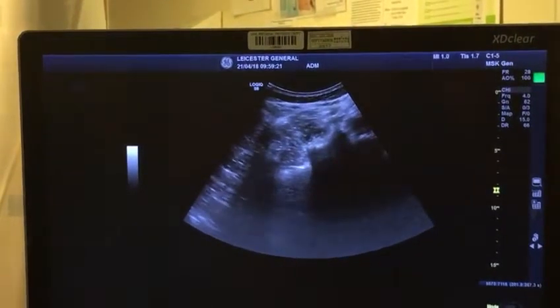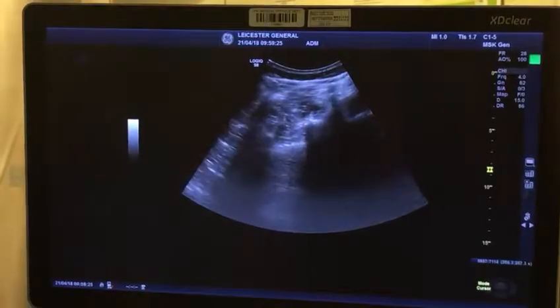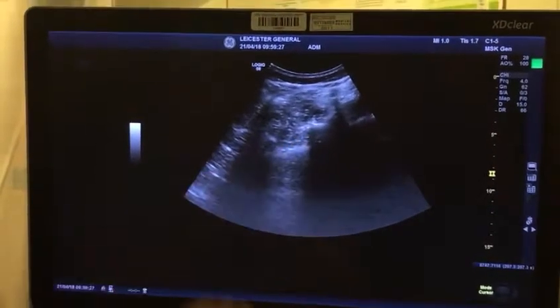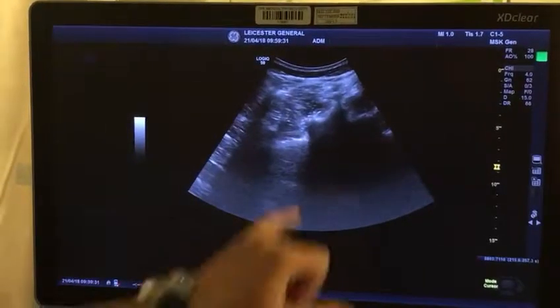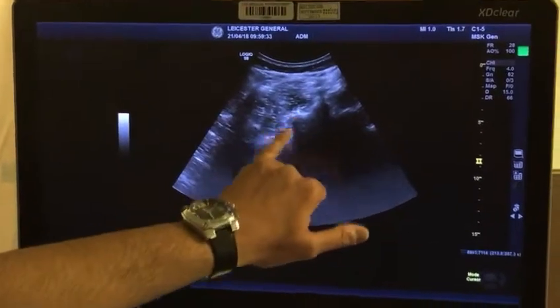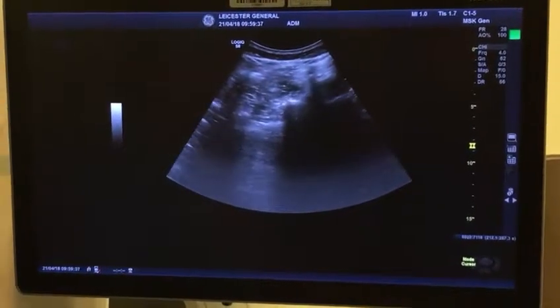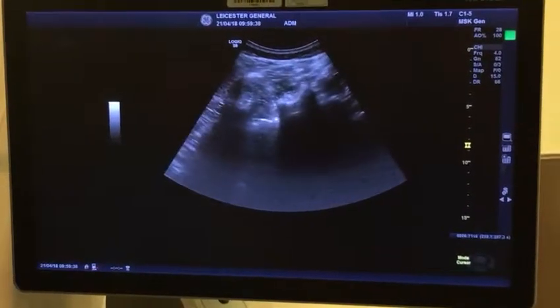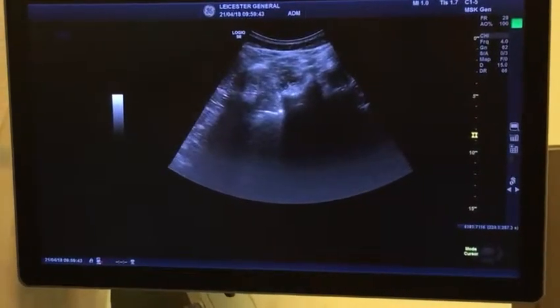Now it's very important to keep in mind that if I move off the target, the next structure I see is a nerve root. Basically, that's the nerve root. So it's very important that you have a really clear bright line between your superior articular process and the transverse process. Otherwise, if you don't have that bright line, you'll end up going into the nerve root. So that's basically the lumbar spine.